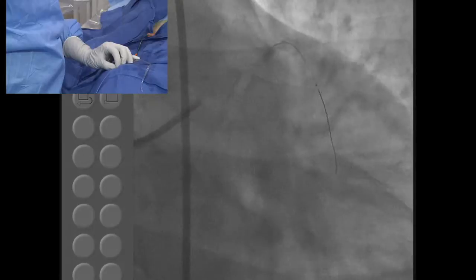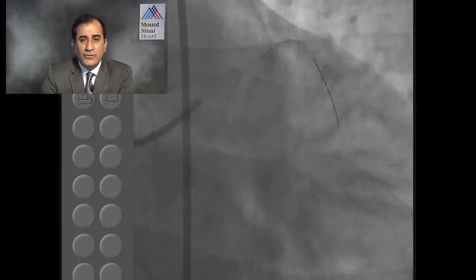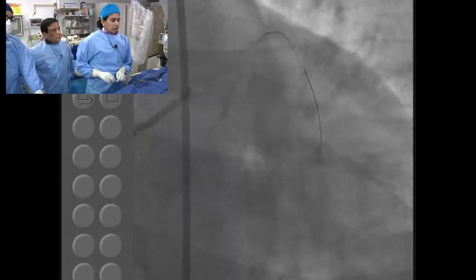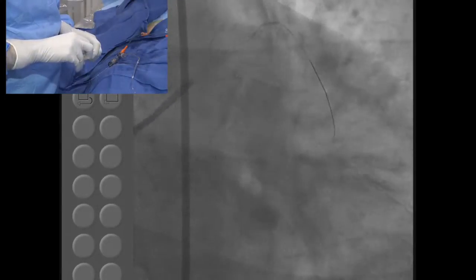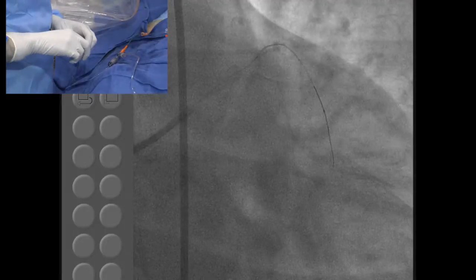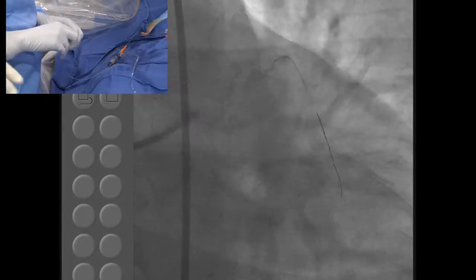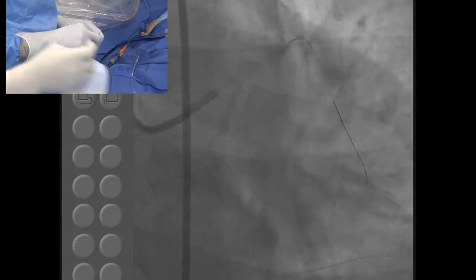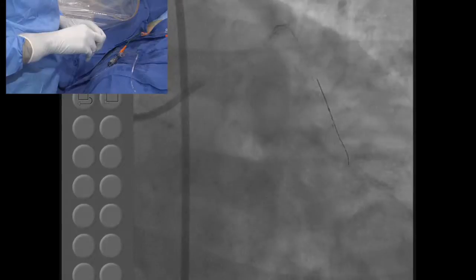Sameen, what has been the change at Mount Sinai with the imaging modalities overall, much greater use of OCT? Actually, our YELLOW trial has completed 80 patient enrollment, but we have to do 80 paired patients. In 2 to 3 vessel disease patients, we do the culprit vessel, and in the non-culprit we do near infrared spectroscopy as well as OCT. If your LCBI is more than 150, then we enroll them in the trial, where they get Crestor for 10 weeks. And then we also get their blood to check the efflux and HDL functionality.